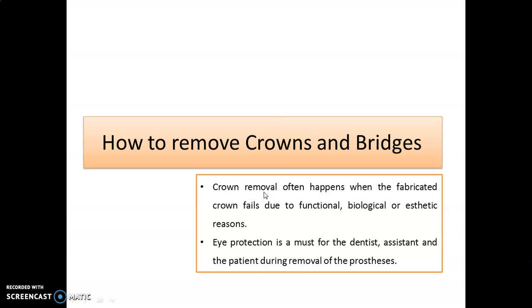So now we are going to study how to remove crowns and bridges. It is a most common topic for your exam. They may ask you the methods to remove crown and bridges. They may give you a scenario in which they tell you if you want to retain an abutment, which method you are going to use, how you will remove ceramic crown, how you will remove metal crown.